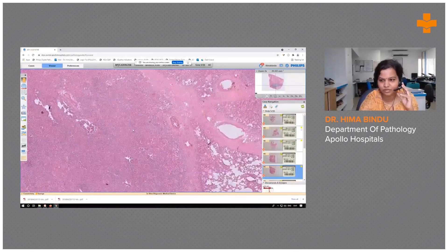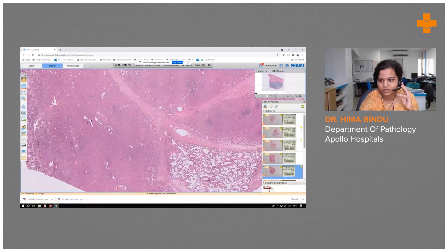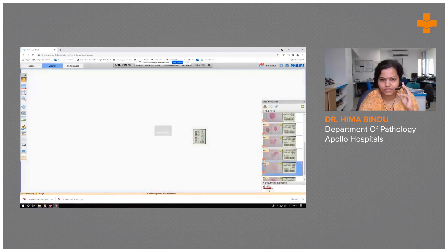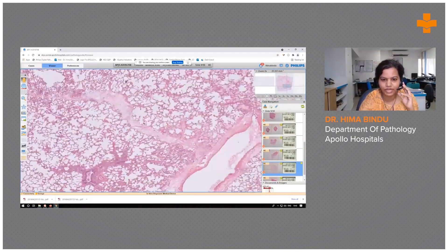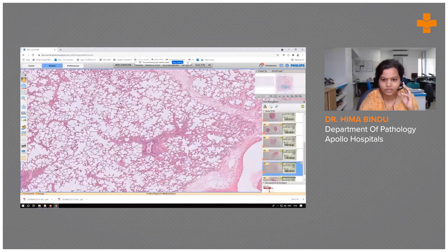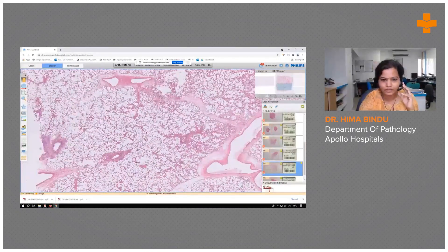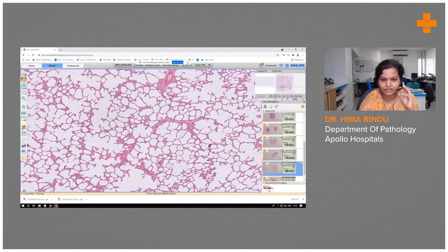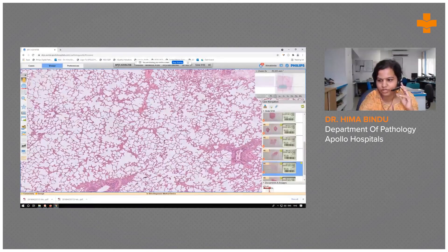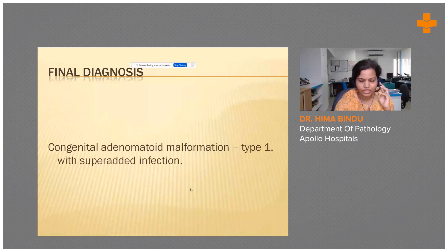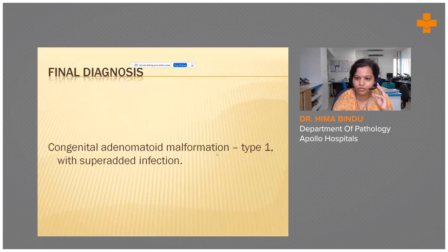There was superadded infection adjacent to the cyst. Sections away from the cyst showed near-normal lung parenchyma. You can appreciate the terminal bronchioles with the pulmonary arteries and normal-appearing alveoli with no significant inflammation or fibrosis. Based on these features, the diagnosis was congenital adenomatoid malformation Type 1 with superadded infection.